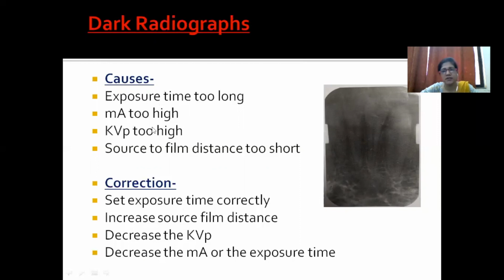For extraoral, yes, we can do it. This exposure time parameter we can change in the IOPA radiograph also.